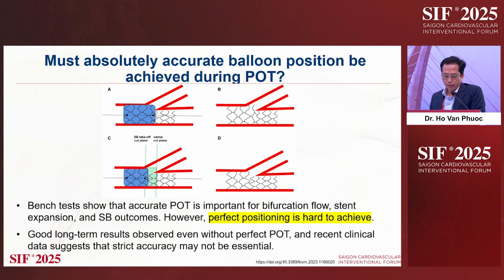And then, regarding execution, that's why the bench test confirmed that accurate POT is vital. Recently, clinical data suggest that good long-term results were observed even without perfect POT, implying that strict position accuracy may not always be essential in the real world. Actually, the perfect position is very hard to achieve in our clinical practice.